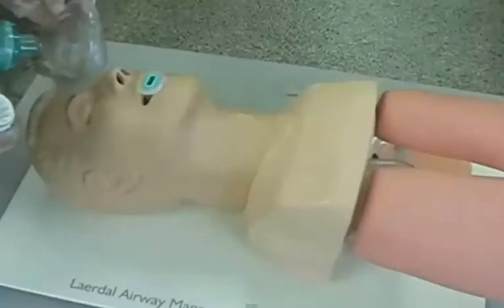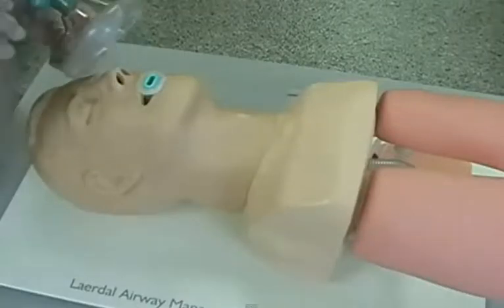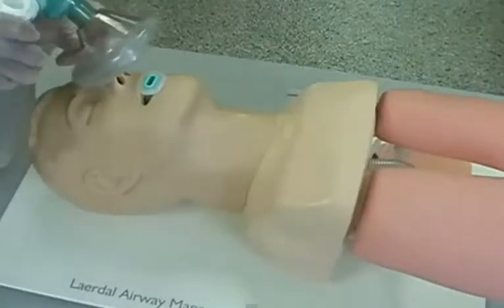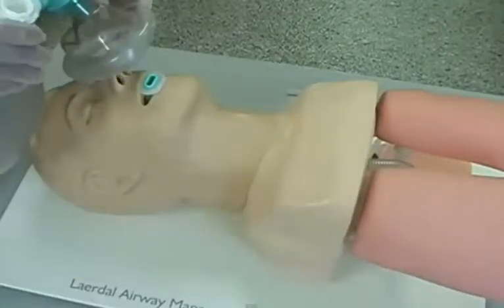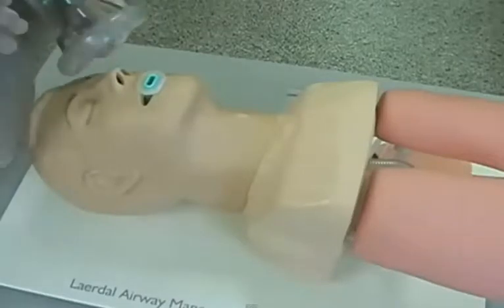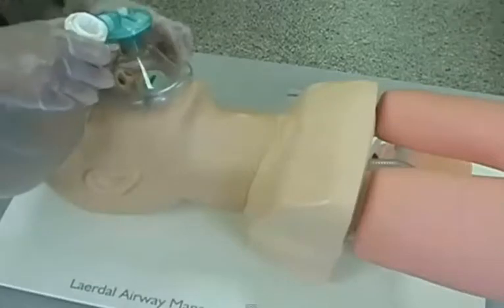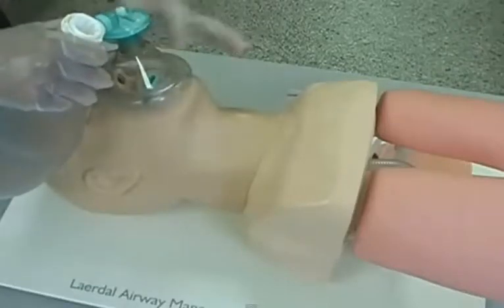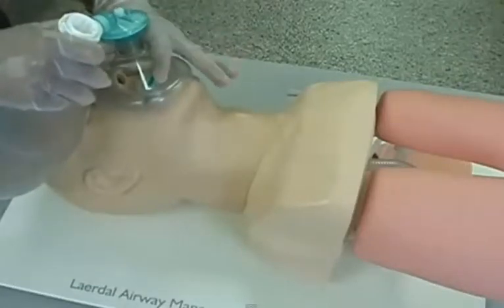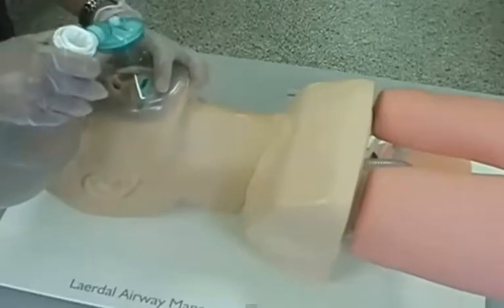When ventilating with a bag valve mask, achieving a proper seal is paramount. If you don't have a good seal, you're never going to ventilate the patient properly. So when placing a mask onto the face, of course we put the narrow end gently over the nose. And placing the mask down, we want to keep our first 2 fingers on the mask, and then we want to take our last 3 fingers and pull the jaw upwards to the mask.